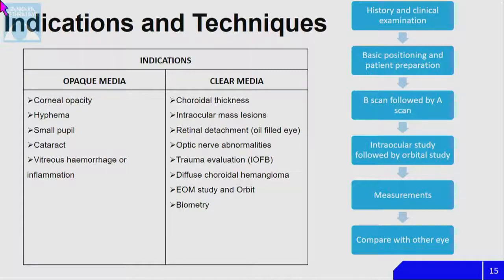And in case of trauma, to examine the posterior segment. And whenever there is a hemorrhagic CD, we follow up the patient for clot lysis, presence of foreign body. Whenever there is a PDR or a TRD, we look for PVD status. So the indications go on and on. And recently, we are using ultrasound-guided subtenon injections; ultrasound-guided anesthesia, though not very popular, is done in a few parts of the world.